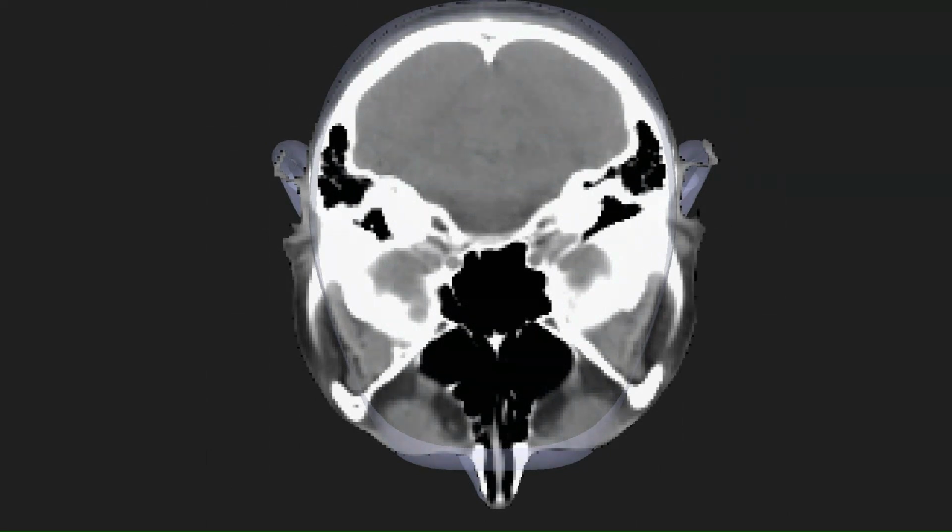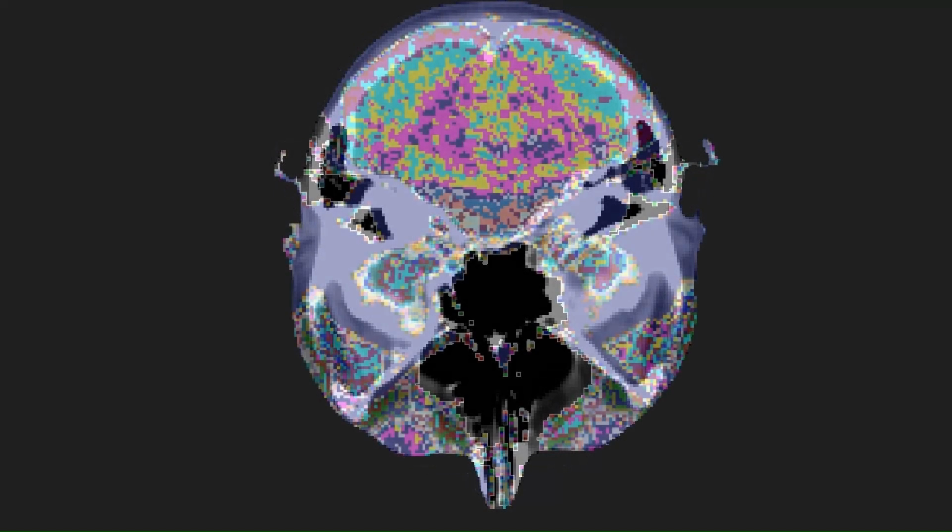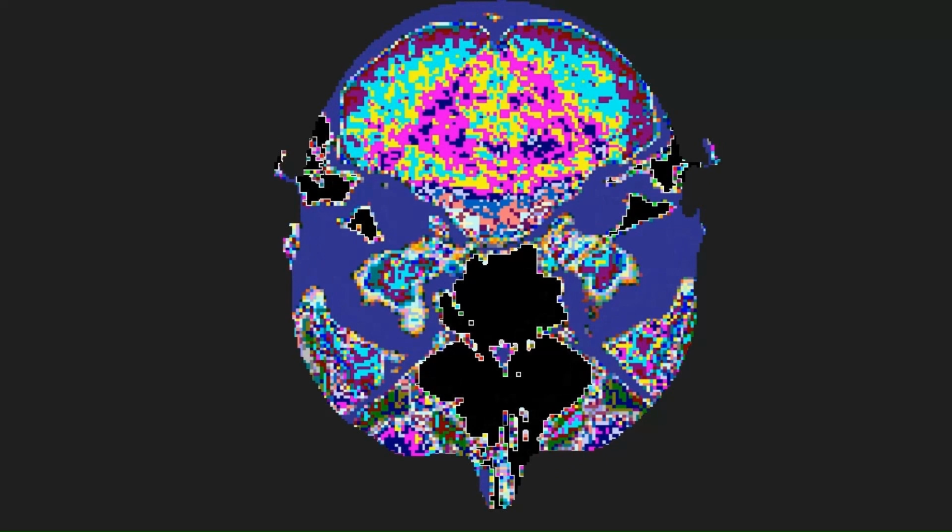The grayscale image is then colorized to highlight the different tissue types, such as bone and brain cells. The pCT image is input into a treatment planning program. For the first time, treatment planning programs will be able to overcome the range uncertainty issue with an apples-to-apples solution. The patient is imaged with protons and treated with protons.